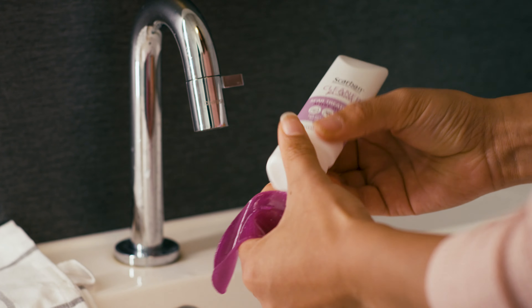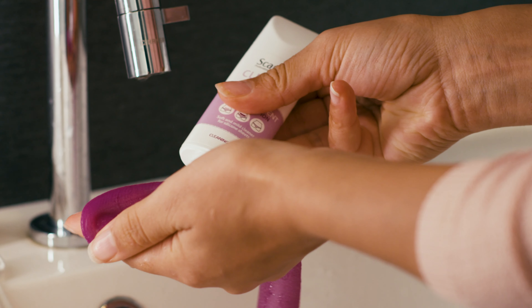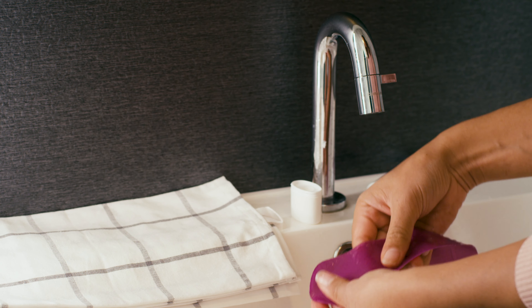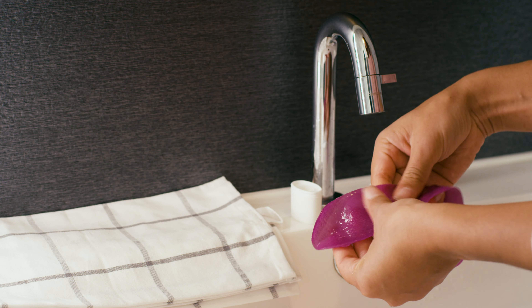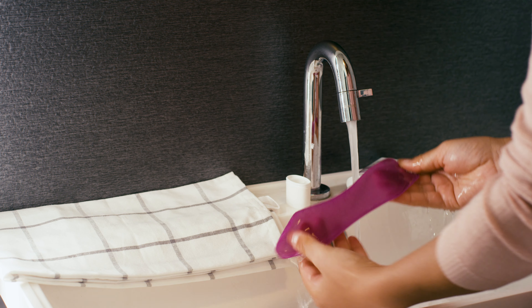Rub the silicone sheets with a few drops of Scar Band silicone cleaning soap or a neutral soap. Remove dirt thoroughly and rinse the silicone sheet well in lukewarm water. Only use the sheet when it is completely dry.